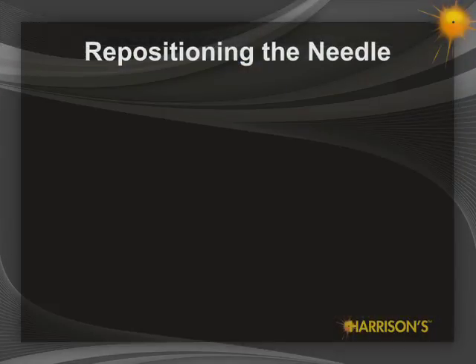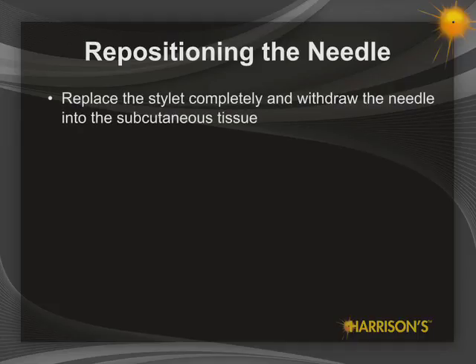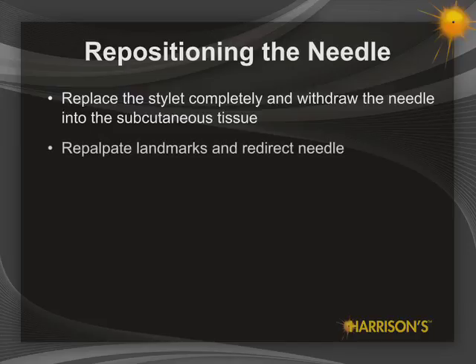If you are unable to access a space because you have hit bone, replace the stylet completely and withdraw the needle into the subcutaneous tissue. Repalpate landmarks and then redirect the needle and reinsert.